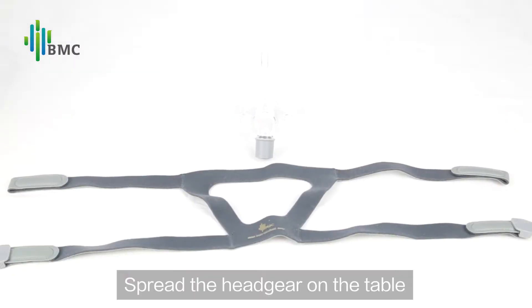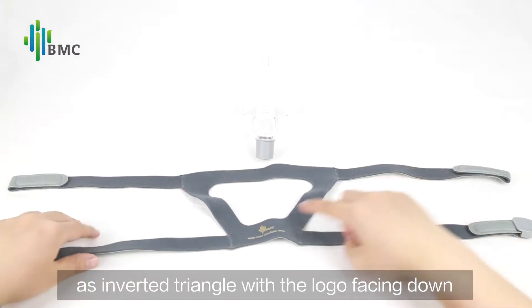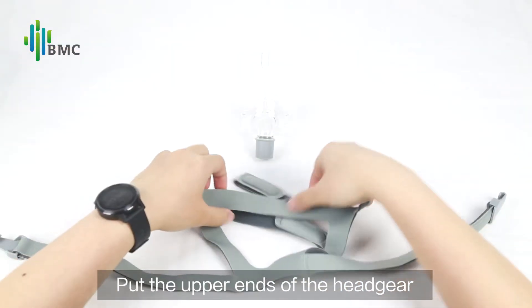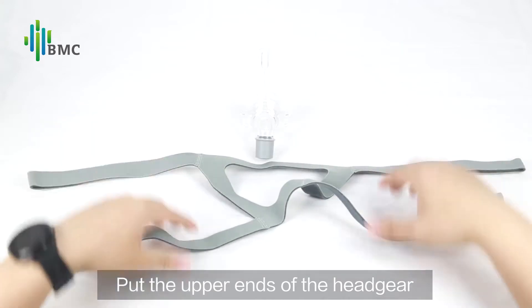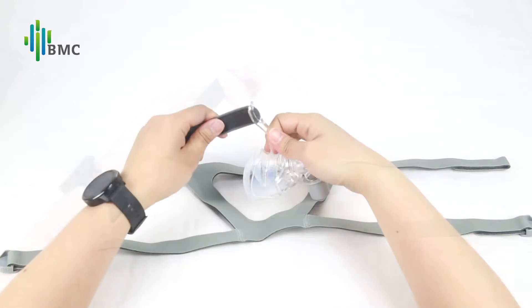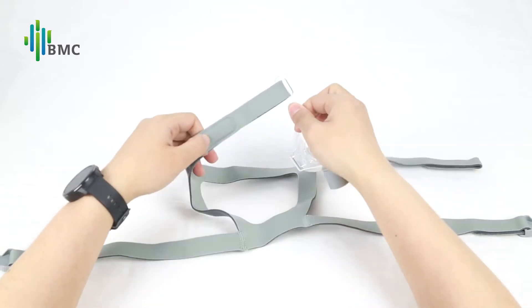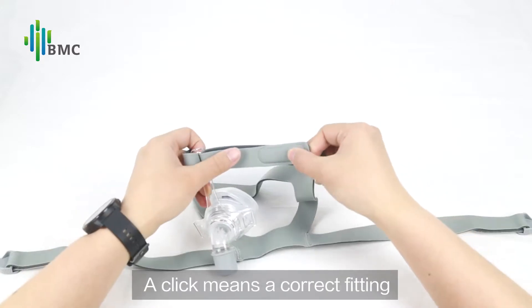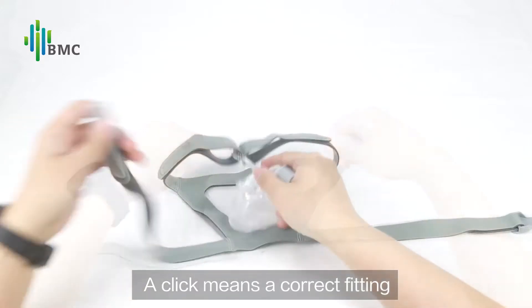Mask Connection: Spread the headgear on the table as an inverted triangle with the logo facing down. Put the upper ends of the headgear into the fitting hole and attach them well. Connect the unilateral clip below. A click means a correct fitting.